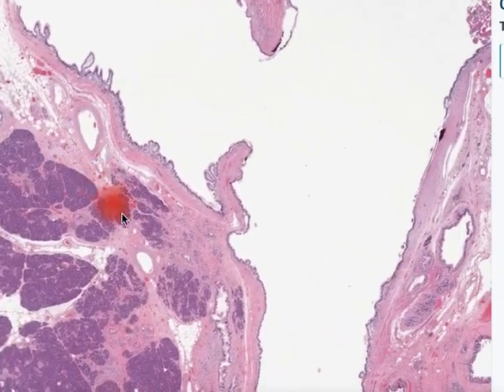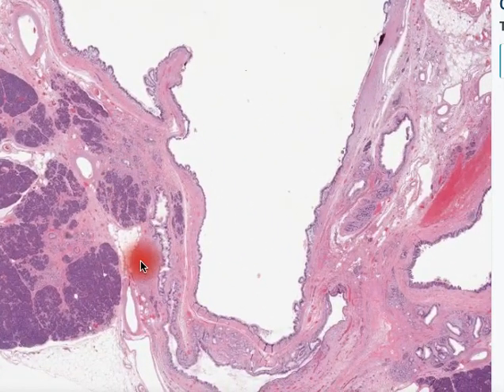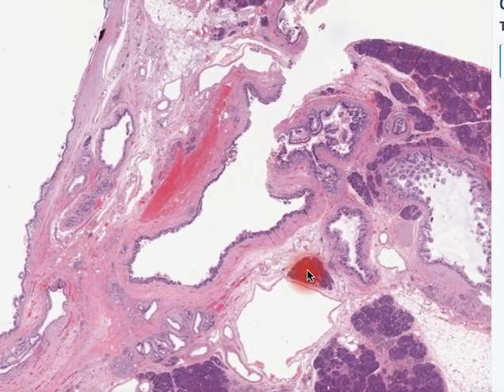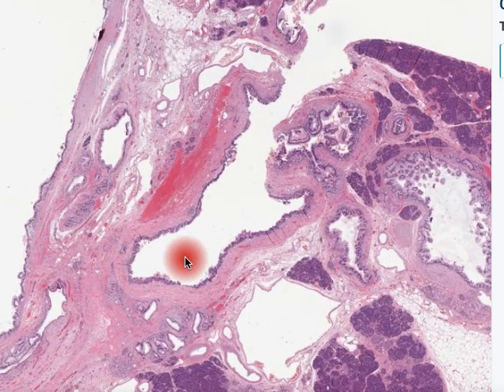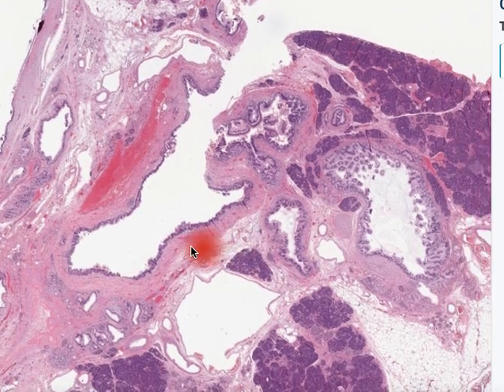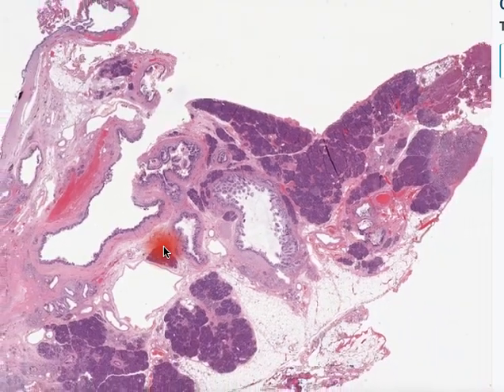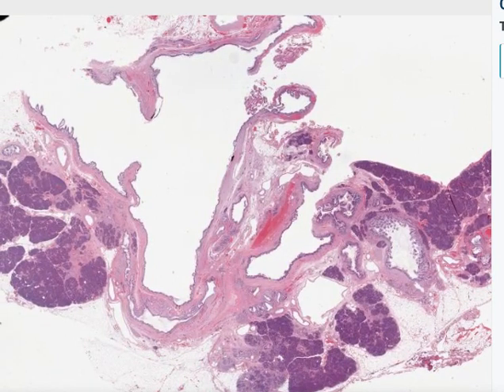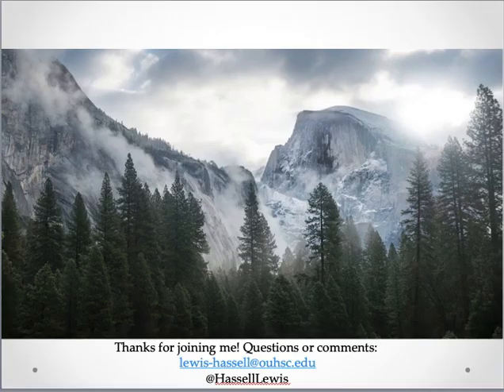So in summary, this would be a nice example of an intraductal papillary mucinous neoplasm of the pancreas. It's not invasive, though these can be associated with well-differentiated adenocarcinoma, either in situ or invasive. And so the prognosis in this case should be very good for this patient. Thanks for joining me on this case number three from the pancreas, a very classic example of intraductal papillary mucinous neoplasia.